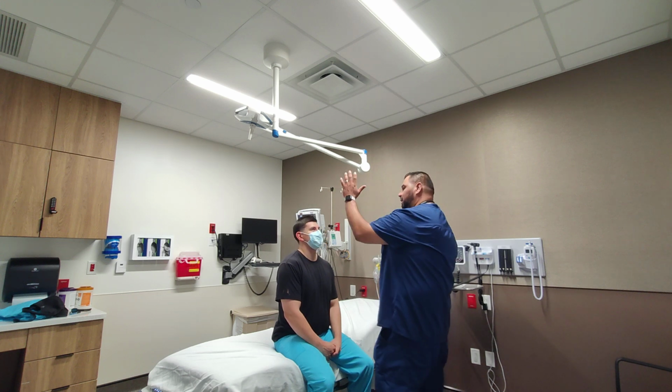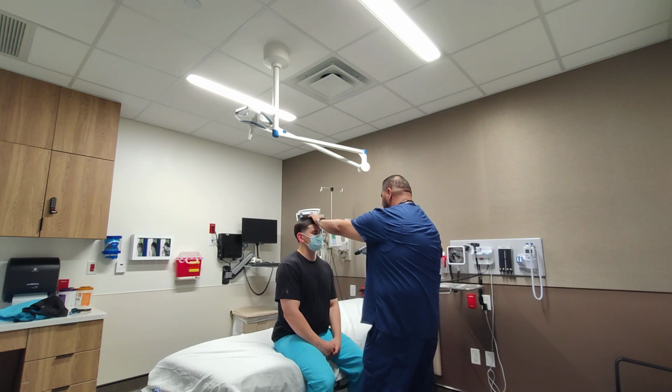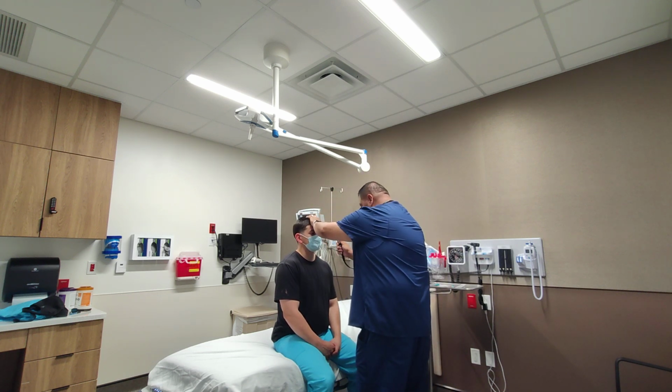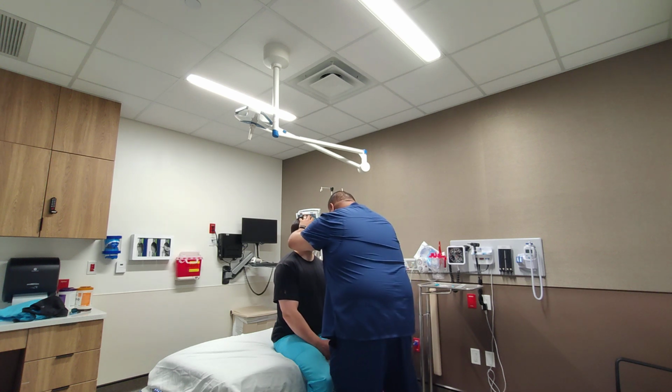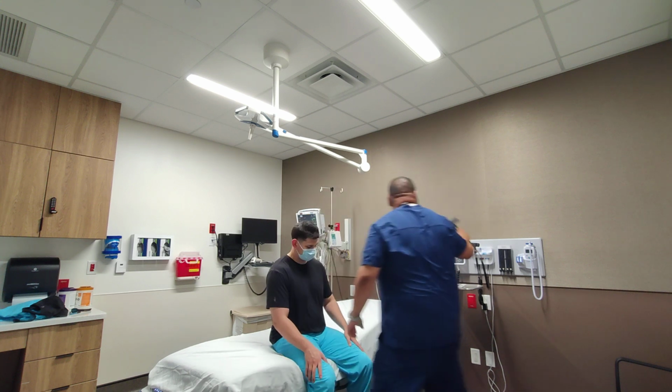I'm going to stabilize his head with my hand, and look inside of his eye. Okay, make sure he's got sharp disc margins. Also looking for any papilledema, any AV nicking. Look at the other side of his eye. No papilledema, no AV nicking. Perfect. Okay.